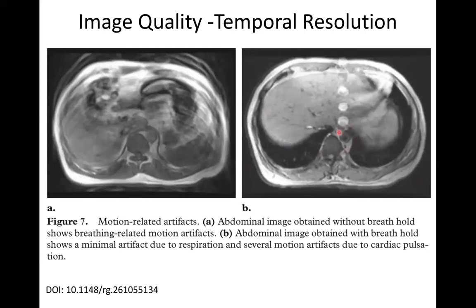But you can also see these replicants of the aorta. This is the descending aorta, and then these are replicants of the descending aorta. The reason they occur is because the image was taken over, say, 12 heartbeats. And so there's a periodic change in the signal intensity in the aorta over those 12 heartbeats. And that periodic change shows up as these replicants in the image. So this feature, as the data is being acquired, is kind of blinking on and off as the flow goes through.